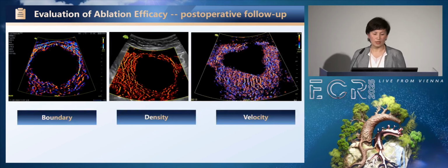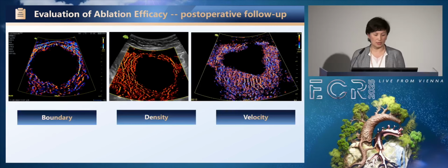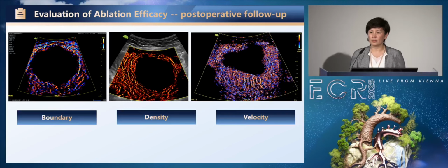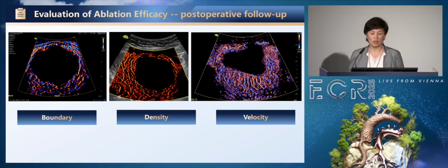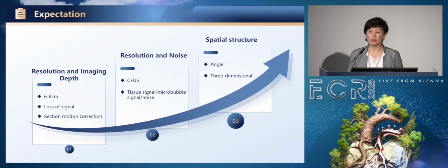Also, after the operation, during the follow-up, we can use this kind of method to see the boundary of the lesion, to see the density of the surrounding tissue and the velocity of the surrounding tissue. So we believe this kind of technique will give us more information during the diagnosis and the treatment.